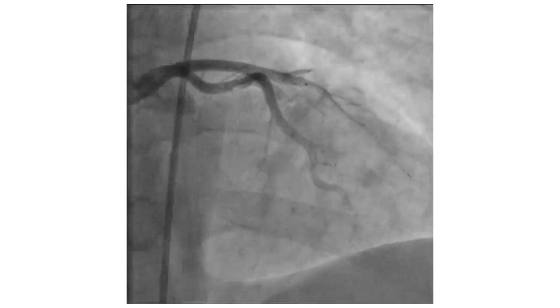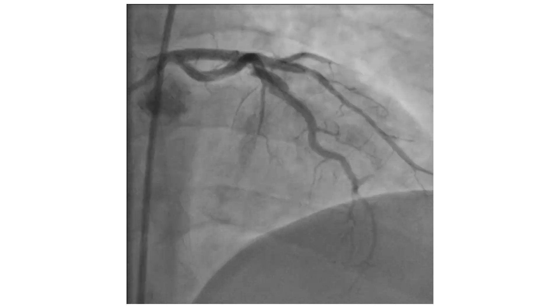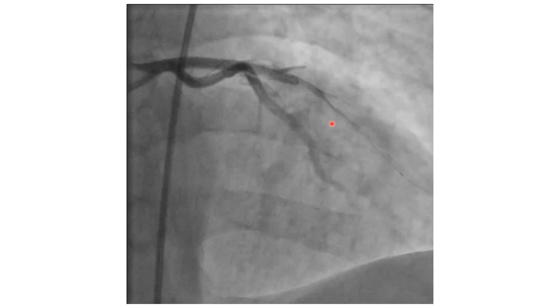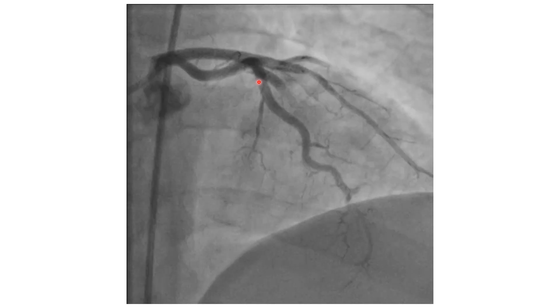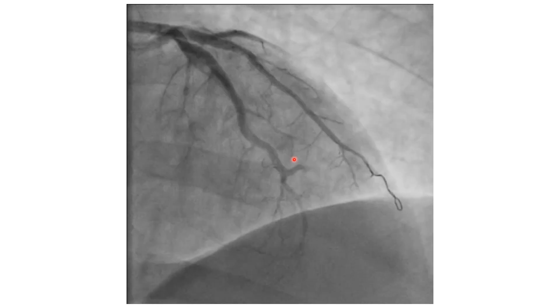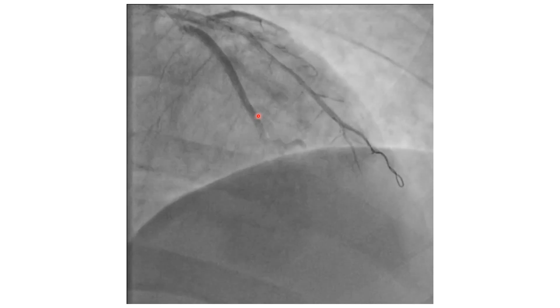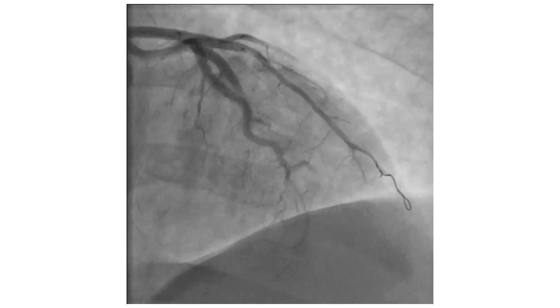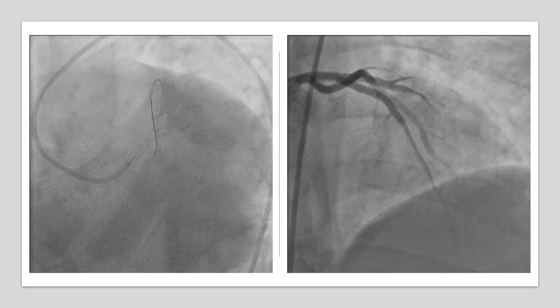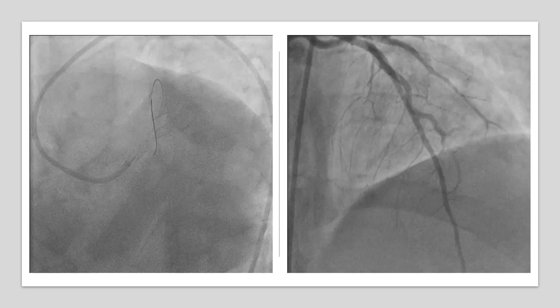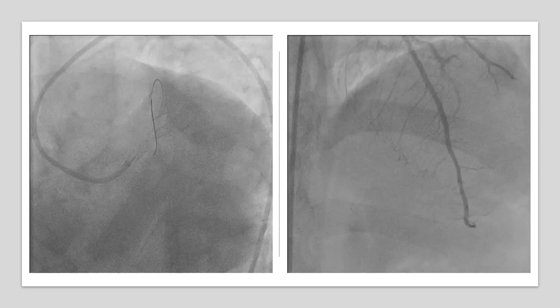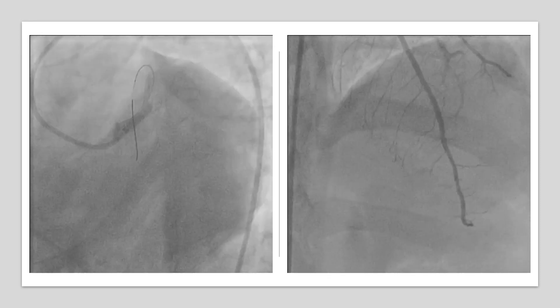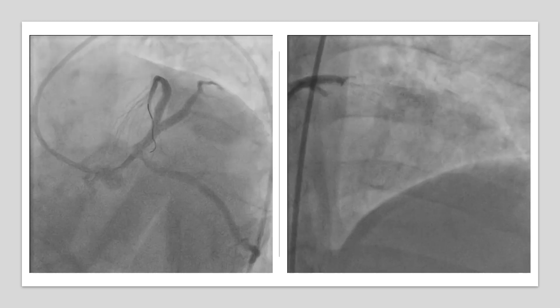The cranial view shows the stent going from the LAD into the diagonal, and this is the proper course — this is the LAD. In this case, the operator managed to wire and distend the proper LAD. And this is the result.